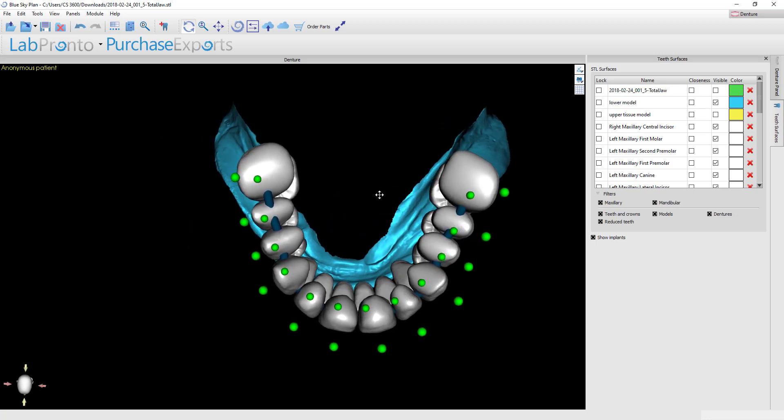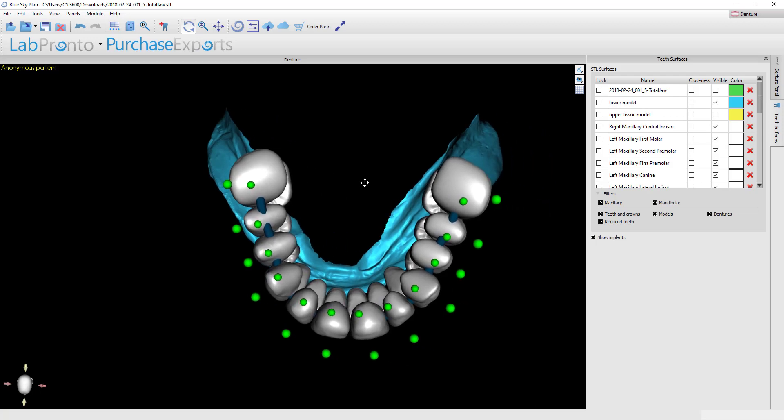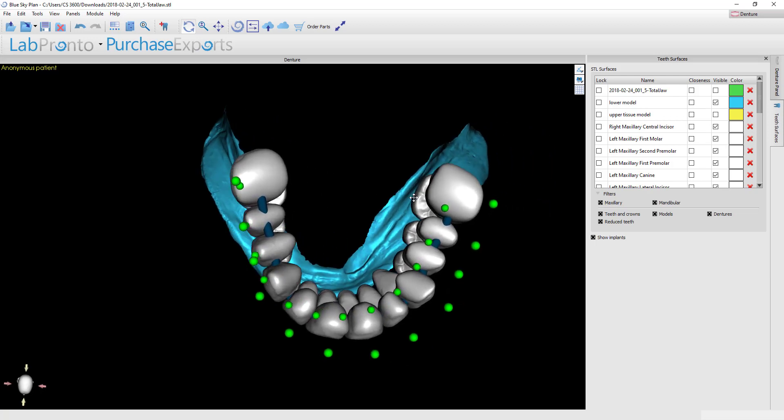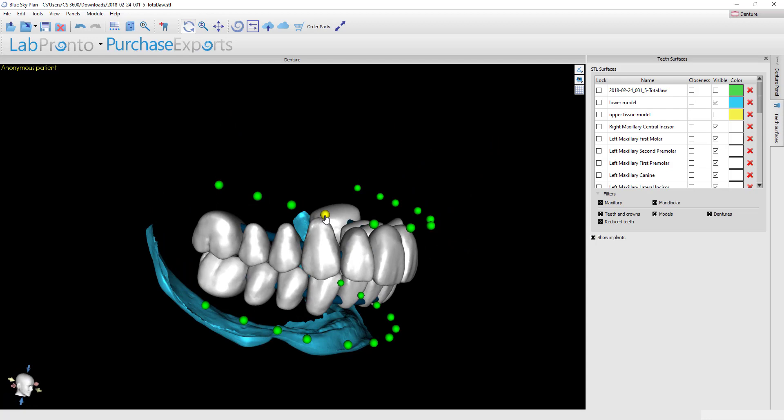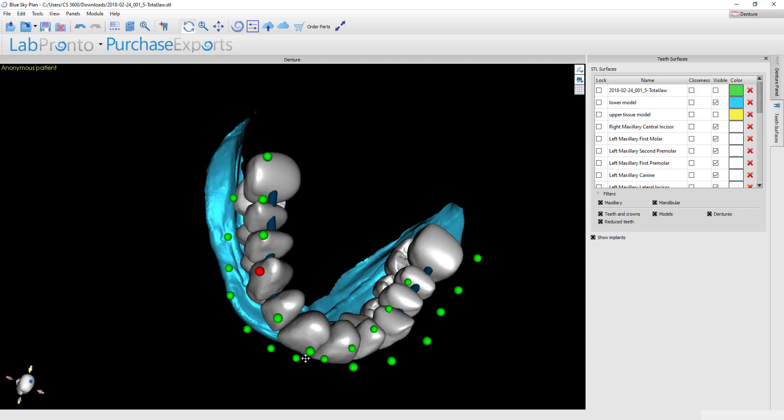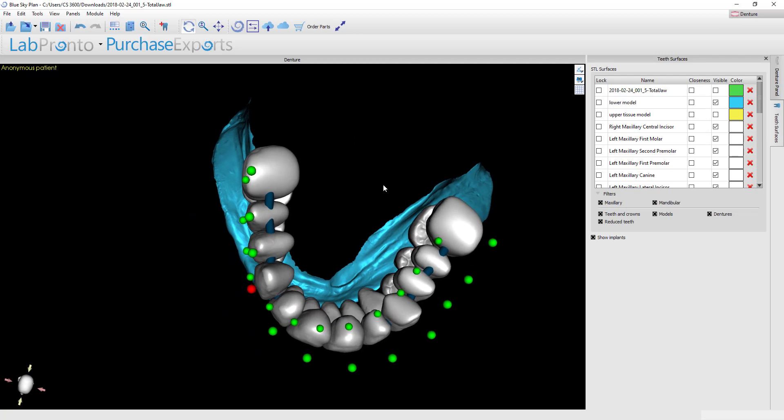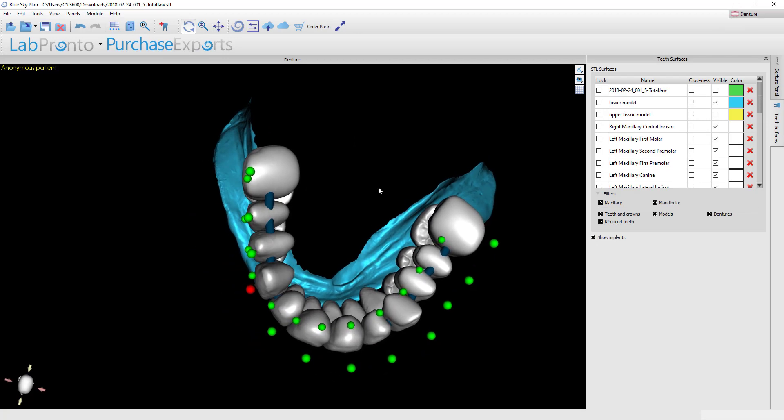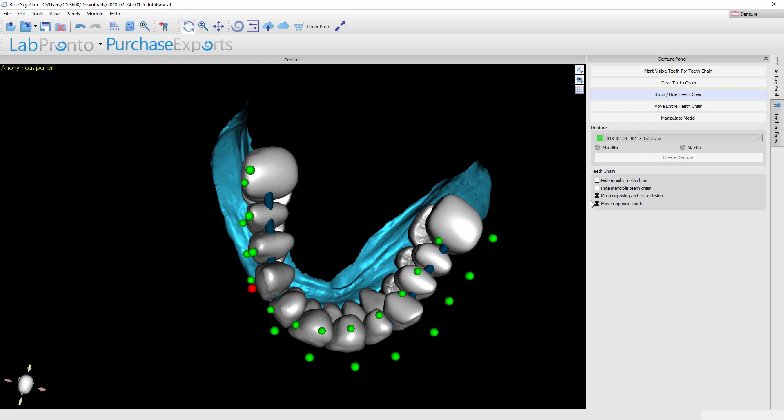If I look over on this side though, it looks like from the first premolar back needs to all hinge outward toward the cheek and that's going to allow them to sit over the top of the ridge more. So what I'll do is lock the tooth at the canine and then I'm going to hinge the entire posterior quadrant over to sit on top of the ridge. I want to make sure though that when I do that, I make sure this button is checked on that says move opposing tooth.